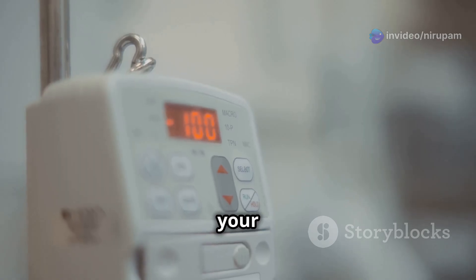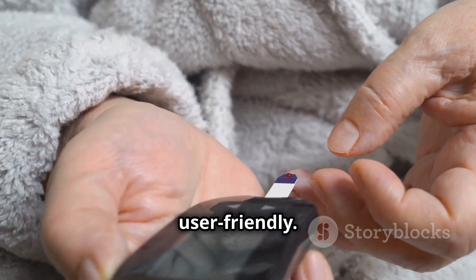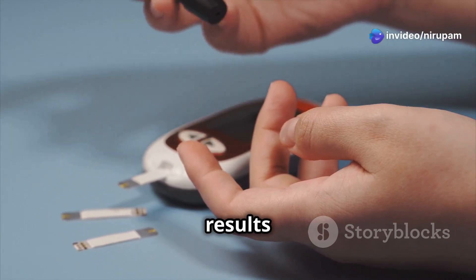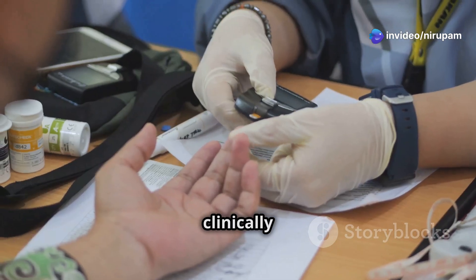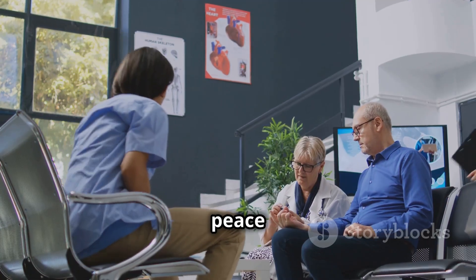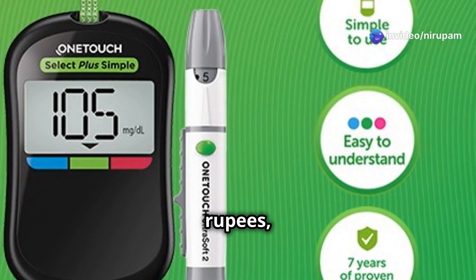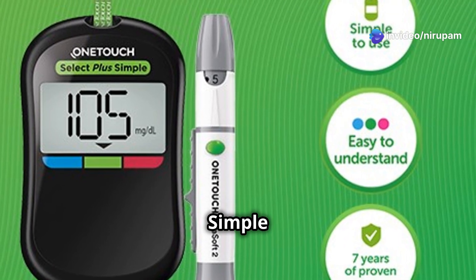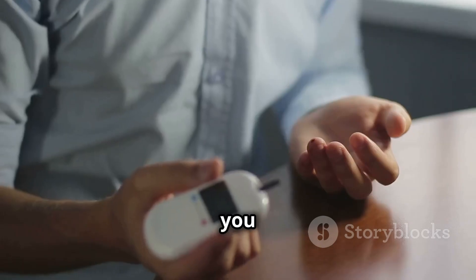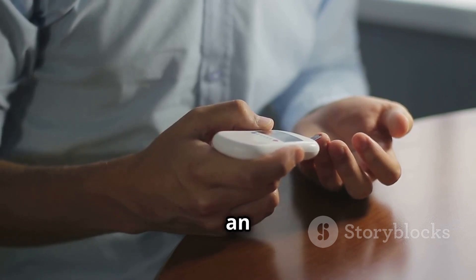It's like having a traffic light for your blood sugar. The One Touch Select Plus Simple is also incredibly user-friendly — just insert a test strip, apply a small blood sample, and you'll get accurate results in seconds. It's been clinically tested and proven to meet the highest standards of accuracy, so you can have peace of mind knowing you're getting the right information. Priced at around 875 rupees, it's a bit pricier than the Dr. Morpen BG03 Gluco One, but if you value simplicity without compromising on quality, it's an excellent choice.